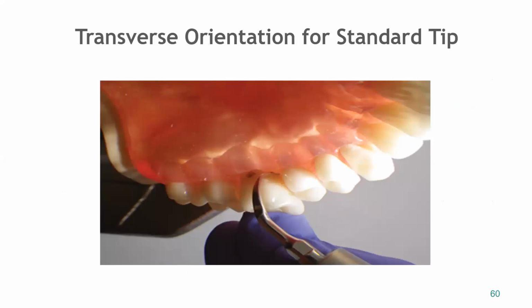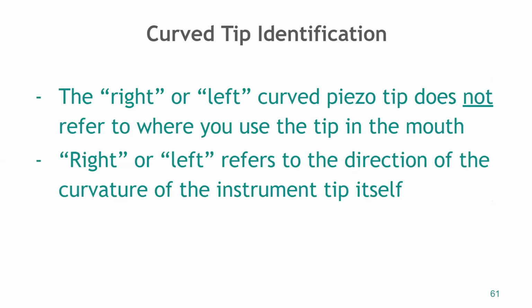So transverse orientation for the standard tip, just showing you, again, working coronal-most portion apically, okay? The right or left curved piezo tip does not refer to where you use the tip in the mouth. Right or left refers to the direction of the curvature of the instrument tip itself, okay?